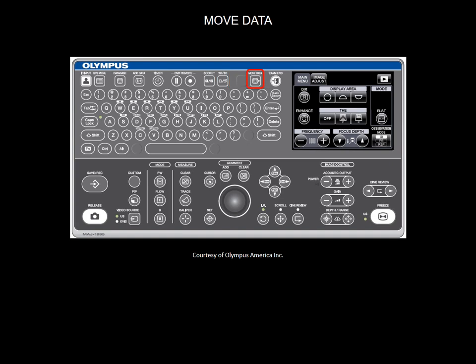The move data allows you to either move old images from old exams or move same-day saved images to your USB drive.